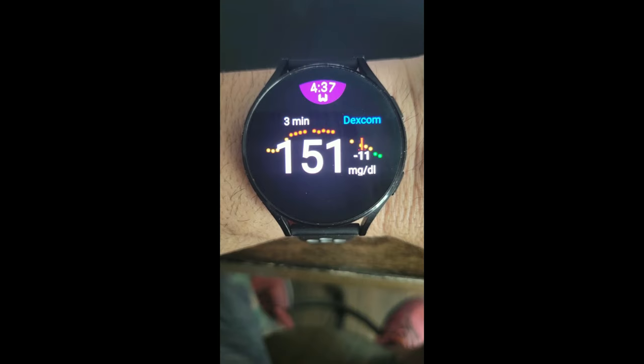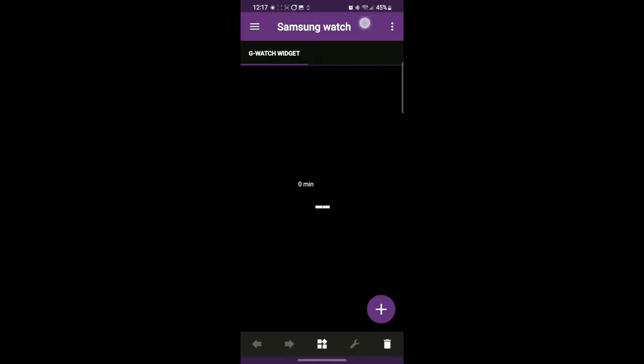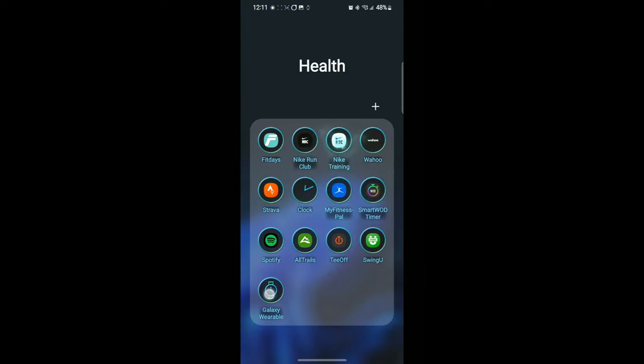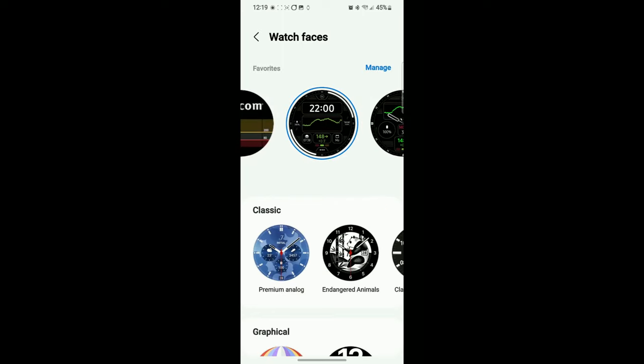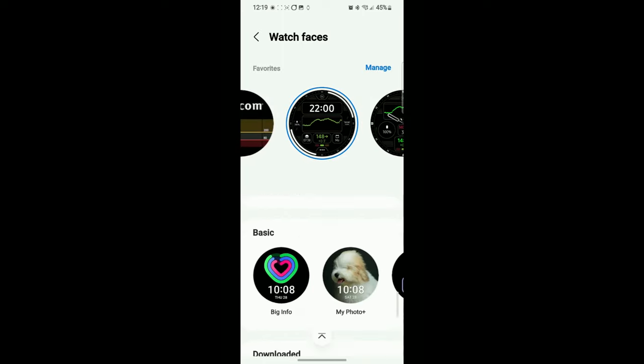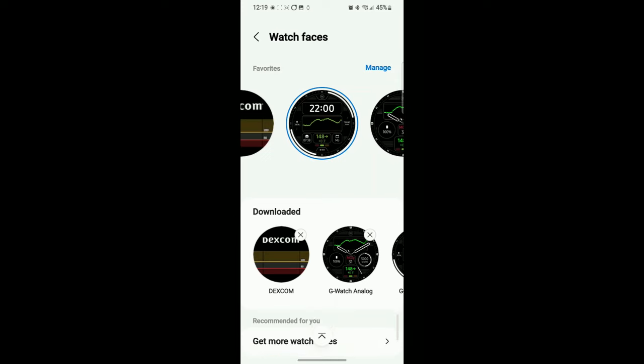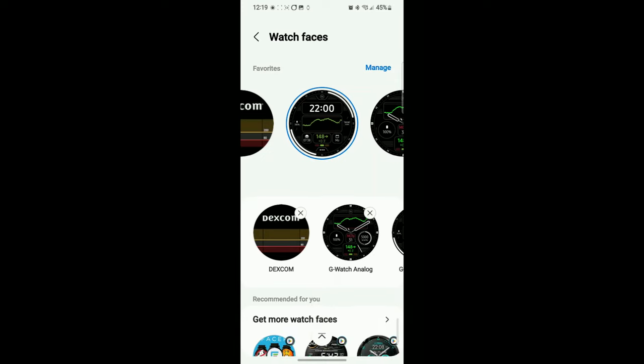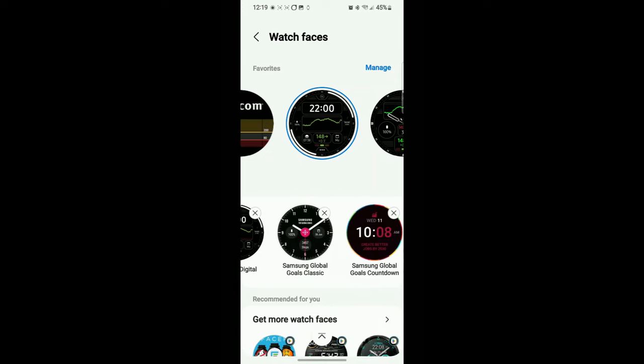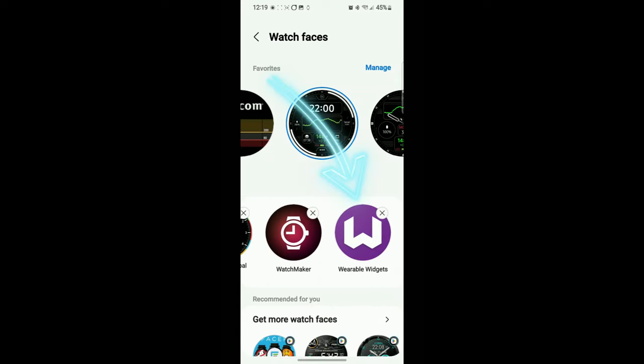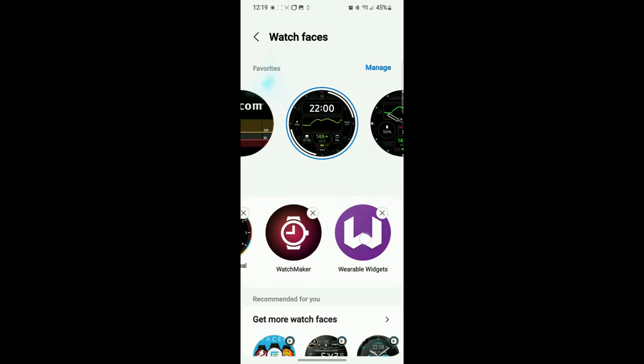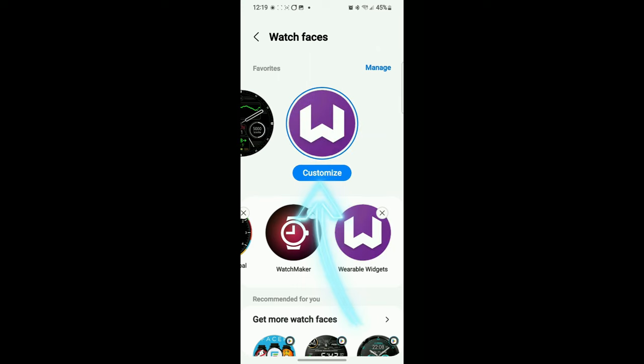So let's go back to the Galaxy Wearable and back to watch faces. We're going to scroll back down to downloaded, but this time we're looking for our widget app, so the Wearable Widget. Click on this one. And now it's going to give us a customize option. So let's customize it.